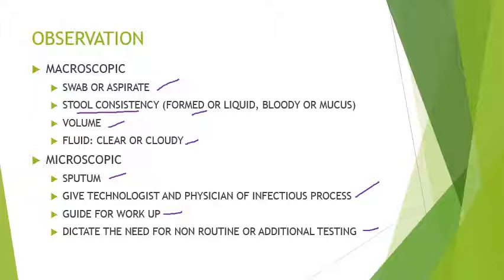Kasi for the vaginal, stool, and cervix, it has normal flora. So, baka mataranta lang kayo, akalain nyo may bacteria. So, hindi siya appropriate. For throat swab, sometimes hindi rin kasi it has normal flora. Okay? It has streptococci. So, meron tayong normal flora doon.